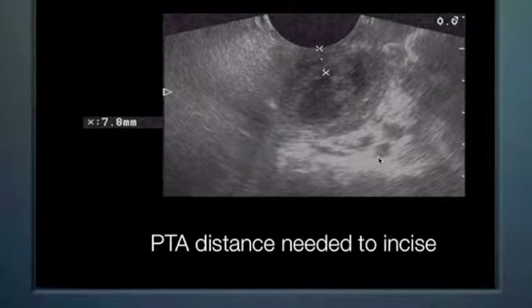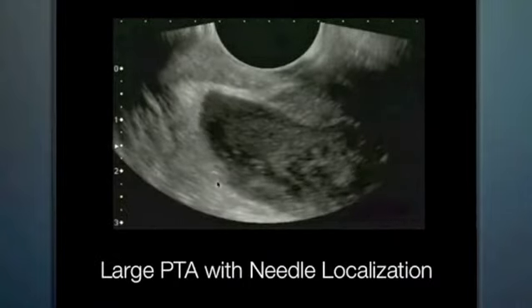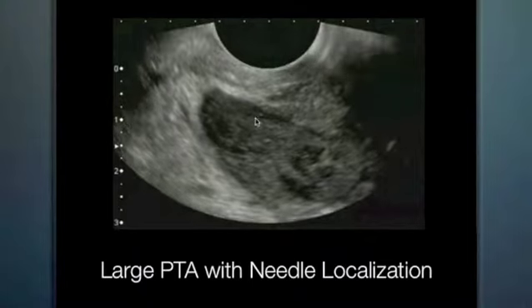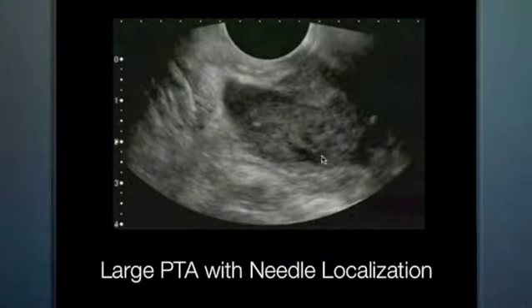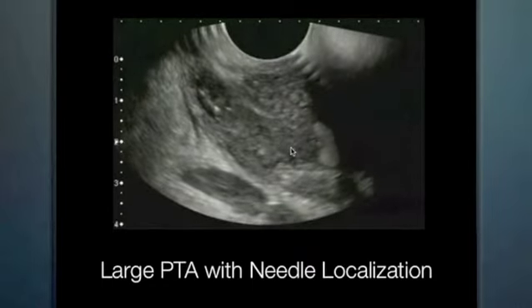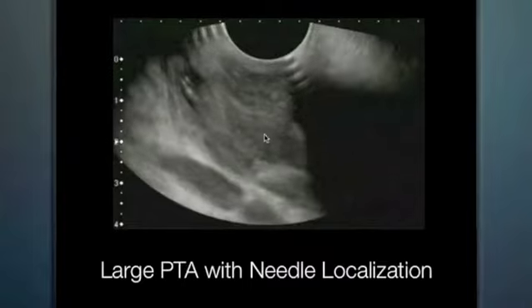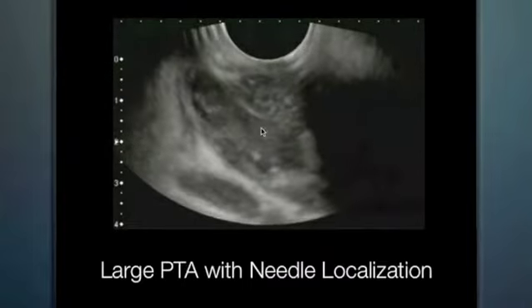And this is a large peritonsillar abscess. We can see it extending all the way down here. As we compress the back of the throat, we can see this is all pus. As we compress it, it swirls around a little bit, and this is very helpful, being able to see this very large amount of pus.